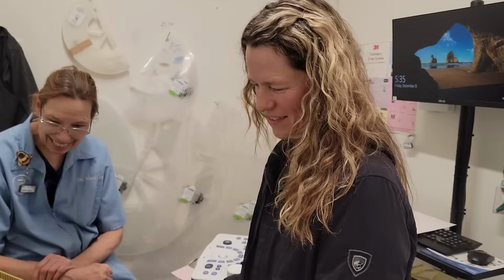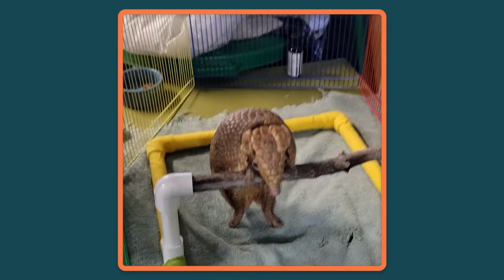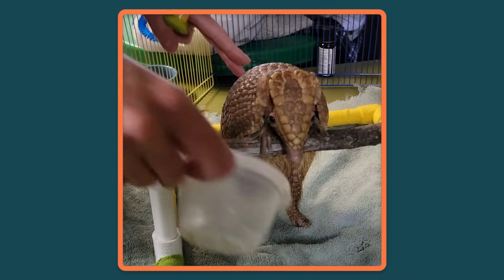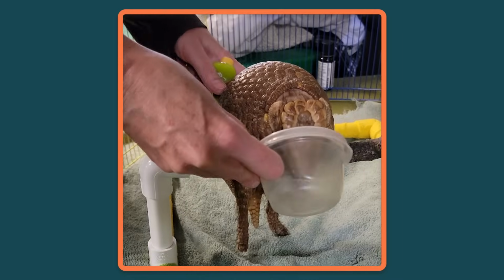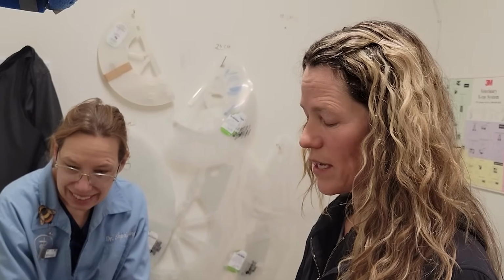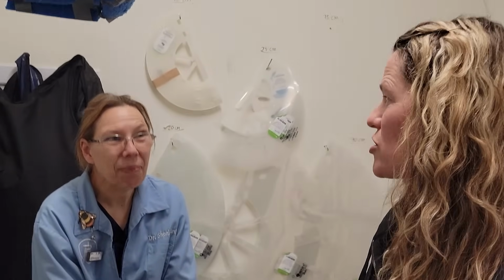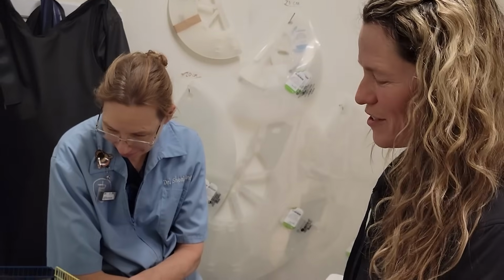So this was great. I was really impressed with how much effort Mariah put into every little step, because Gaia didn't just have to go up onto this perch here. She also had to have someone touch her belly, and then put all that pressure on there. And we hadn't gotten to the wet, slimy stuff yet. We didn't do any wet, slimy stuff when we did our practice time here, but I had been dipping it in water a little. I had been using the target stick and just touching her, but I had not applied as much pressure. So that was new for her today. It's the very first time.